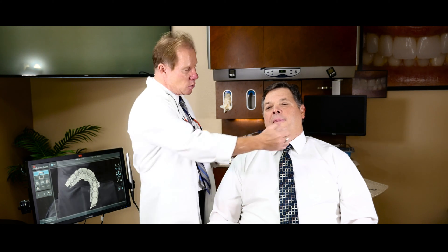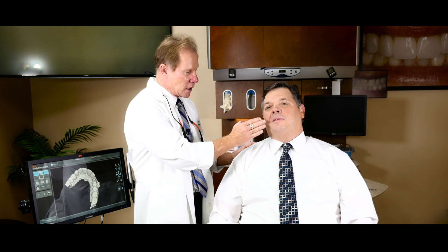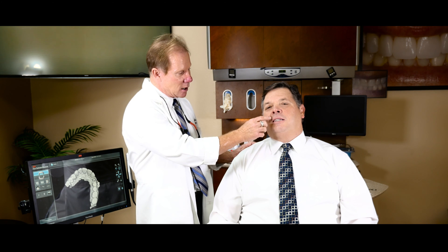With Kim, since we're replacing a canine, we went on the left side all the way back to the molar and came to the second premolar on the right side, so that the lab can duplicate the shape of the contralateral tooth and we get a great mounting. Also the computer will tell us if we have a good mounting — we see that instantly instead of the laboratory calling and saying they can't mount the case. We've all encountered that and it's a huge problem.